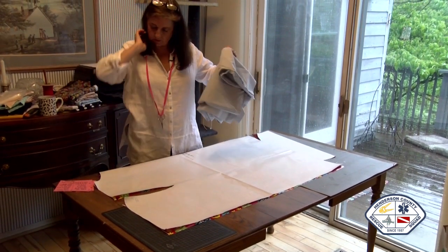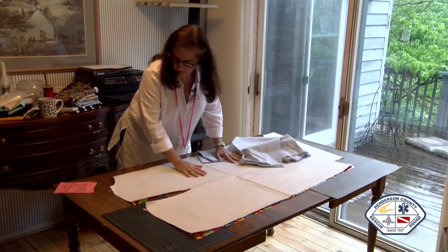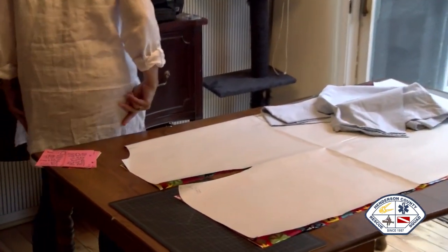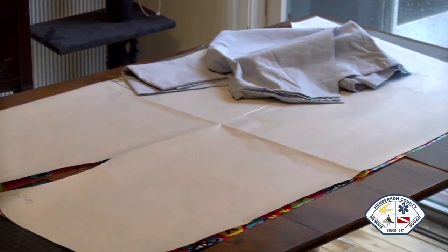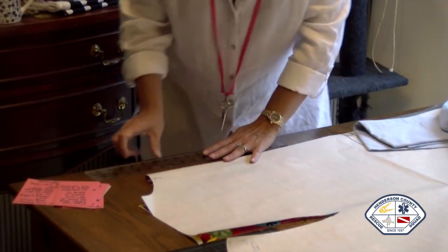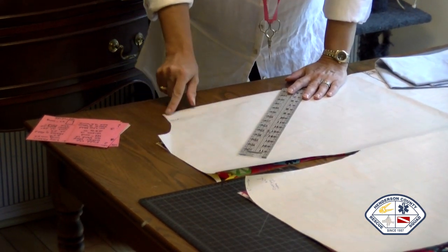On the fold of your pattern, you want to mark 3 inches down, maybe? Well, oh, wait, it's over here. Hang on. 3 inches down and 4.5 inches across here. This is going to be cut and turned into your neck.